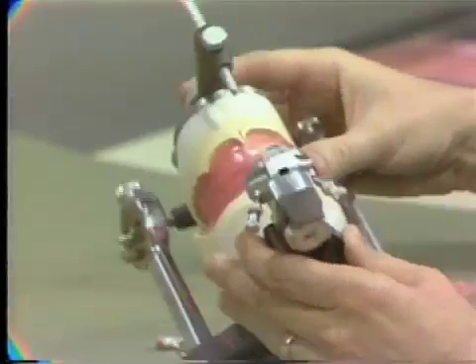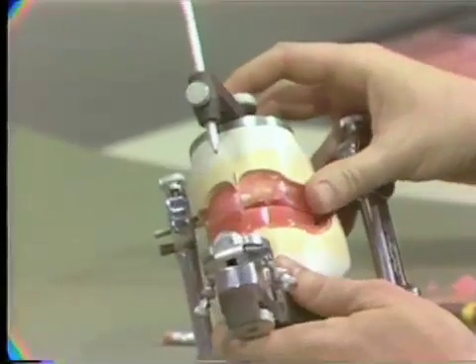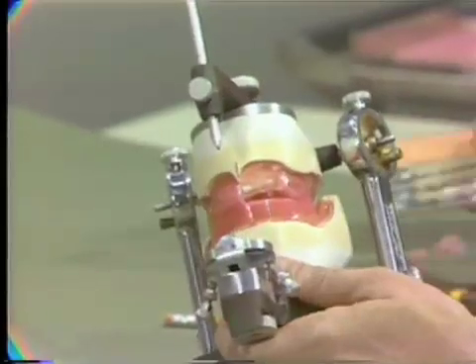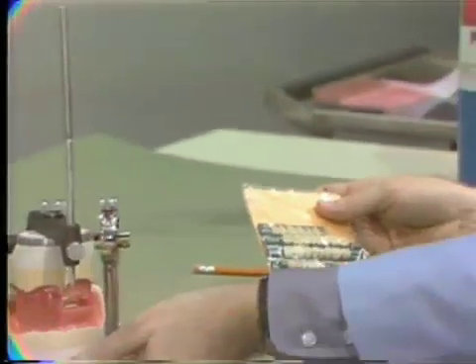Now that's the first step. We remove the wax and we do not set these teeth in the large mass of wax. Now before we set a tooth, just let me make a comment or two about the teeth that we are using for the course.